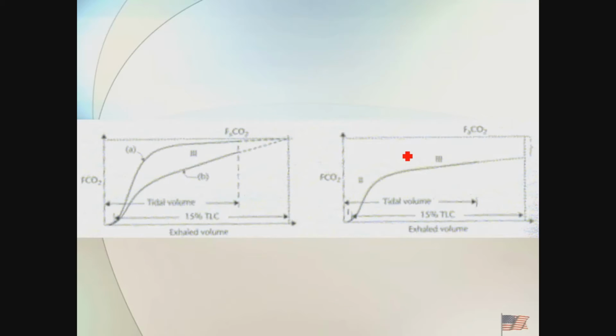It's kind of hard to read, but it's basically showing where this B here is somebody with a pulmonary embolus. This is somebody who has a normal. You can see there's that maldistribution of ventilation there, and a big dead space fraction.